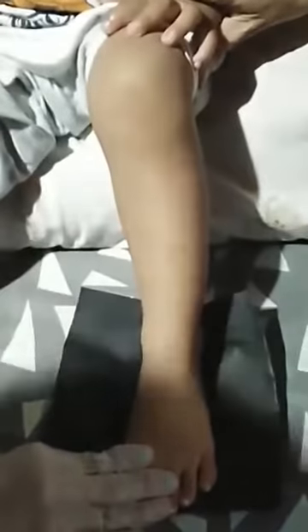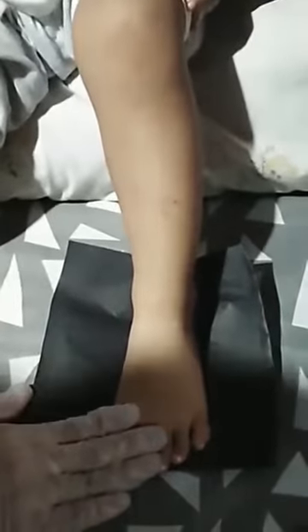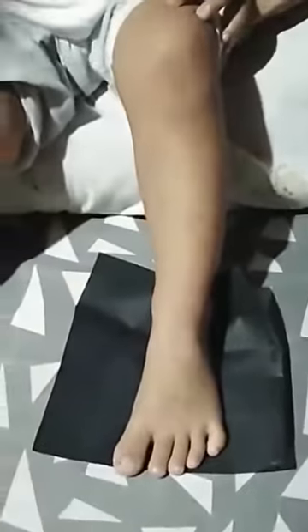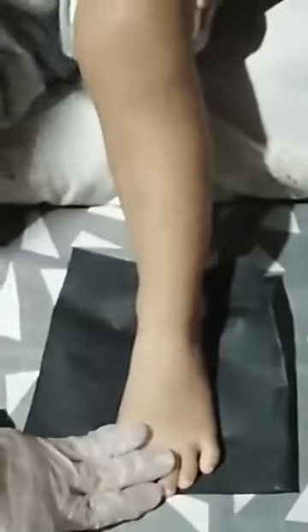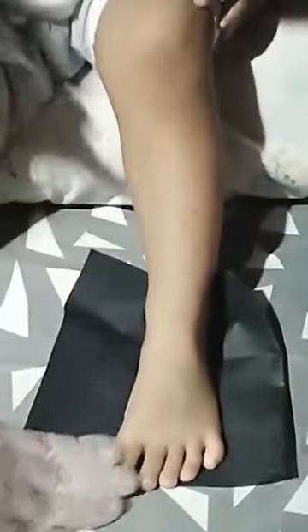rotation of the leg shadow. Hold the infant's knees together in such a way that the legs are exactly vertical. Using a lead glove, hold the infant's toes when the adduction deformity is too great to permit correct placement of the leg and feet for bilateral images without overlap of the feet. Each foot must be examined separately.